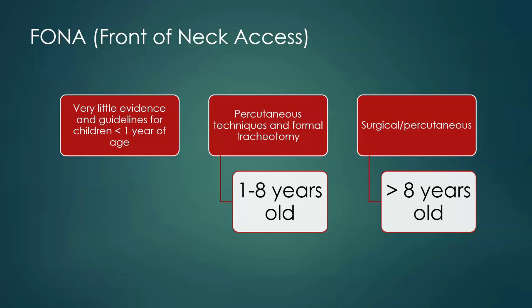There are multiple videos out there. Some of them are very, very fine motor skill events, and a lot of the equipment we might not necessarily have as well. If you aren't familiar with this equipment, it's not suggested that you do the procedure. You don't want to be doing a front of neck access when it's the first time you've ever seen what a Seldinger technique pack looks like. So use what you've been taught, what you're used to.